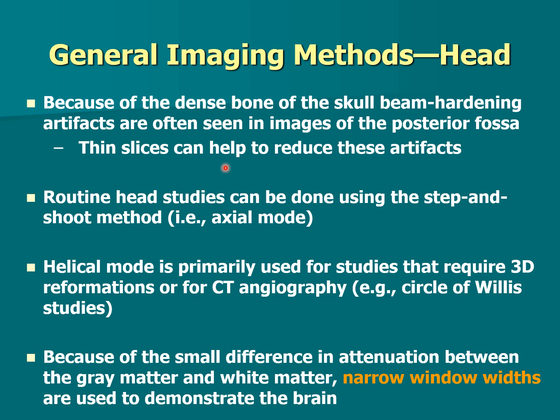It would be more likely if there was a very specific area that you had to have the highest resolution, that you might do the step-by-step scanning. The helical mode is used primarily for everything that we do because we can do 3D imaging, and we have to have it if we're doing CT angiography to see the vessels lighted up. So we'd have to have it for that.